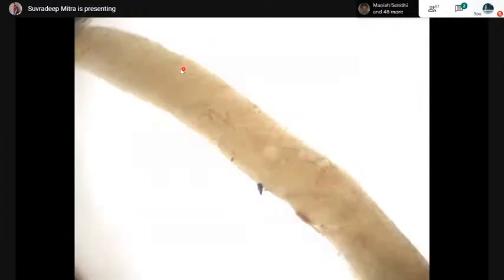So when we get just one core and you do not have any core for direct immunofluorescence or electron microscopy, what do you do? Ideally, you should have a dissecting microscope or a stereo microscope under which you can look at the core biopsy and find out which area is the glomerulus. You can divide it underneath the microscope and submit one part for electron microscopy and one part for light microscopy. But not all institutes, including our institute, currently have the facility for a dissecting microscope. So sometimes we just take help of our light microscope.